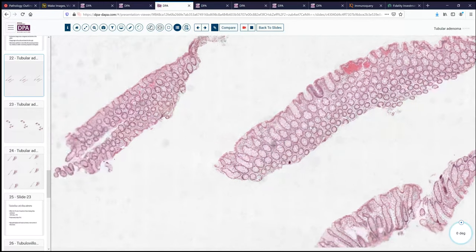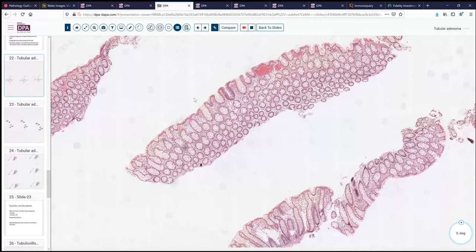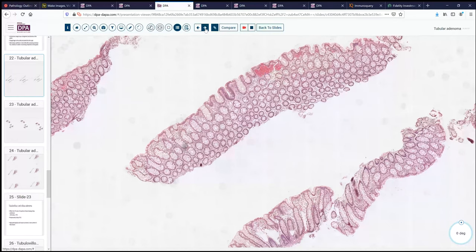This highlights one of the features important to remember in managing these cases: these lesions can be very focal and can sometimes be missed with traditional sectioning. If you have an astute endoscopist who says there's a polyp there and you don't see it on your sections, then it may be a little bit deeper into the block. So we usually will section more deeply if it's going to make a difference in management, such as if it's the only lesion that has been resected.